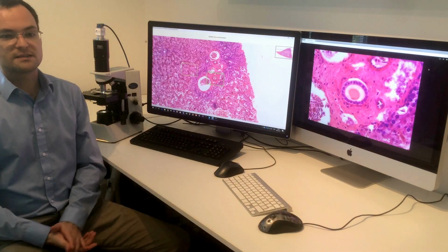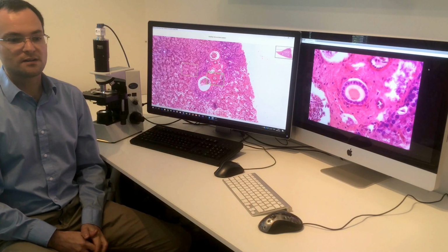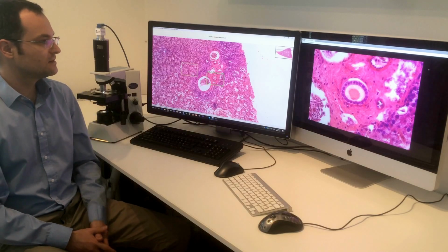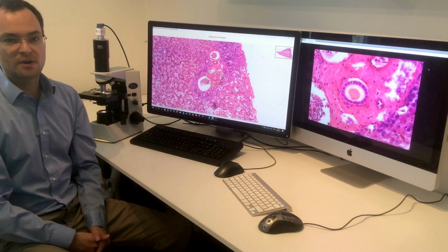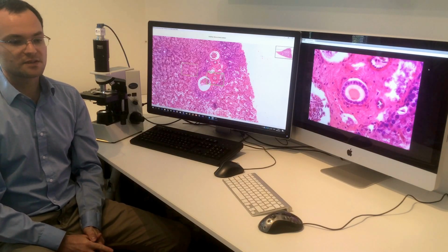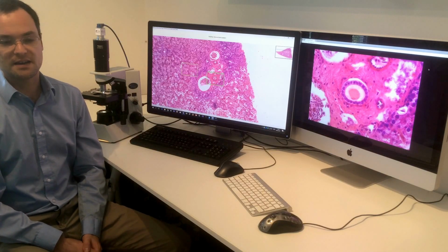So you see, it's an interactive approach to quickly show a slide to anyone on any place in the world. And it's very easy. The remote computer only needs a browser and the URL to the SlidePeek system here. And it's very easy to set up.